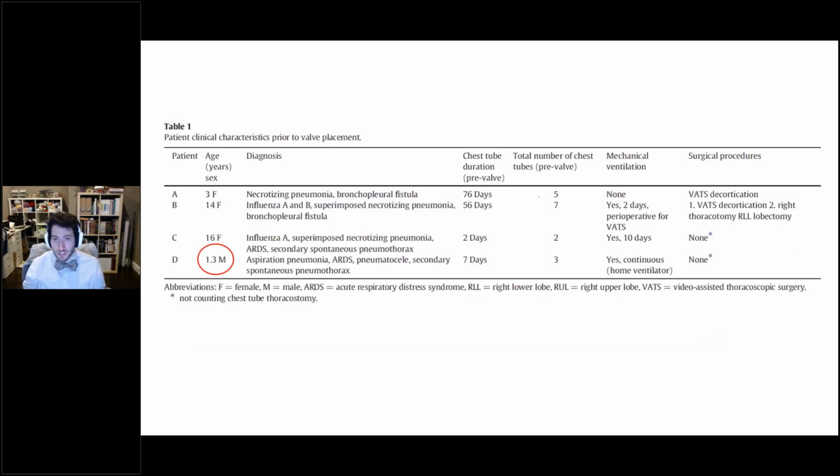You can't fit the adult therapeutic scope in a child who's less than 2 years of age. It's just not doable. Now, this is important for us to talk about because the deployment catheter requires a size of 2.6 millimeters, and almost all of the pediatric scopes, whether it's the 160 or the 180, most of these have a working channel of 2 millimeters at most.